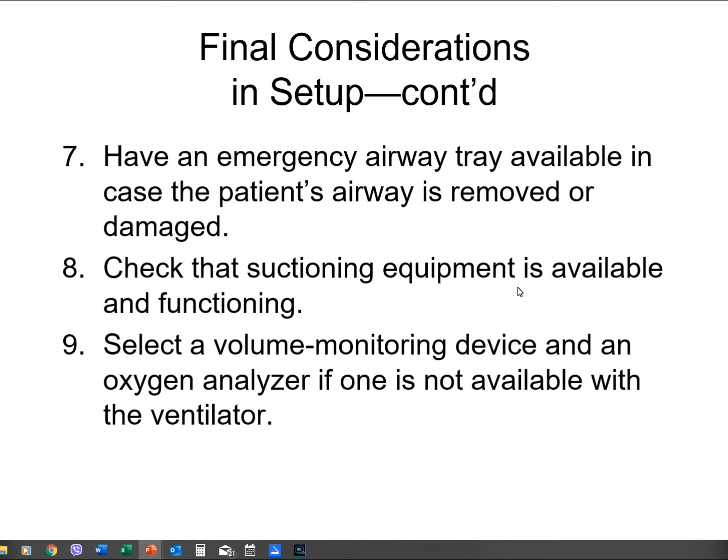Okay. And then number 9, select the volume monitoring device and an oxygen analyzer. Now, oxygen analyzer, you're talking about periodic maintenance of your ventilators. Your biomed person at the hospital will be the one to look at your oxygen analyzers, see if they're fixed or not.